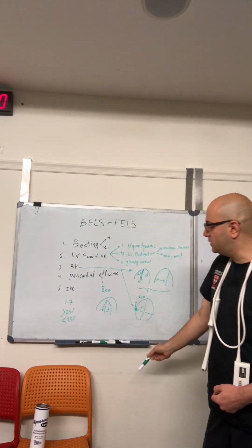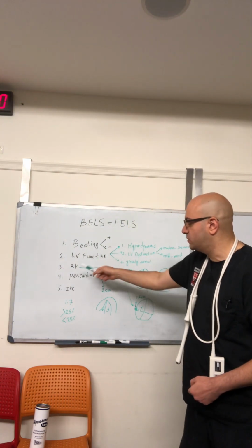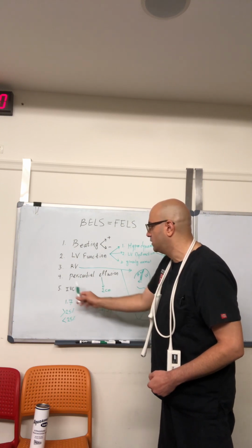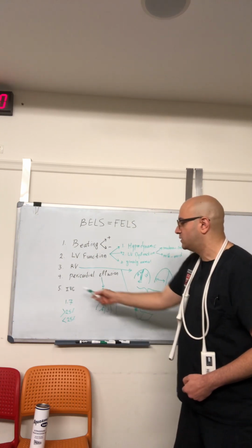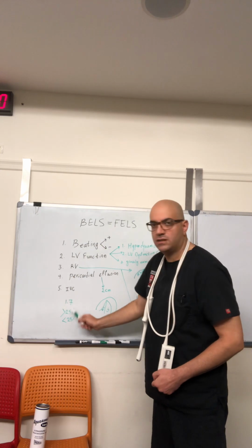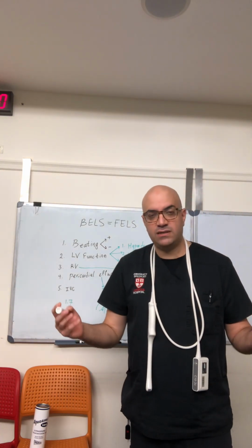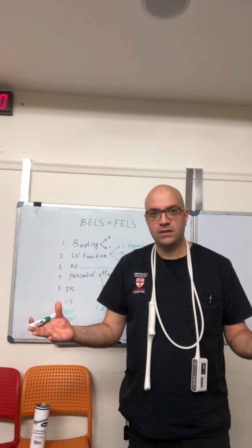Answering these questions: beating, yes, no; LV function; RV; pericardial fluids, yes, no, and how much, is it significant or not; and IVC, what is the size, what's the collapsibility? Will likely give you an answer about your patient's fluid status.